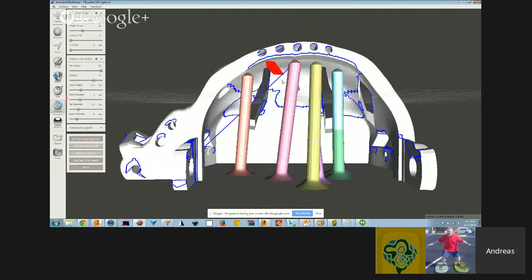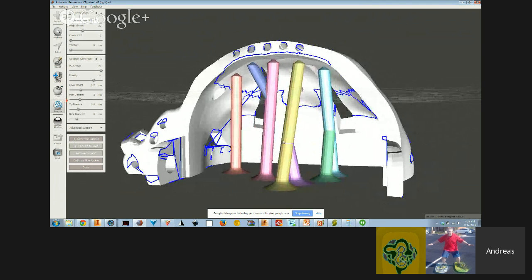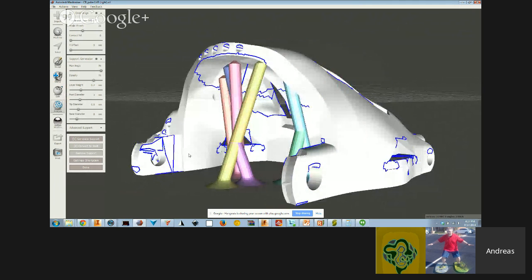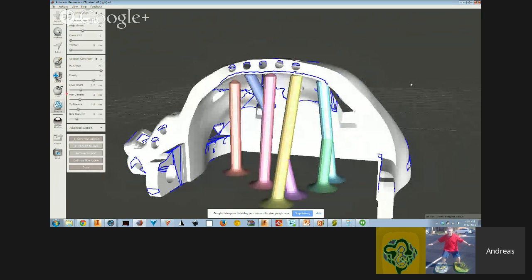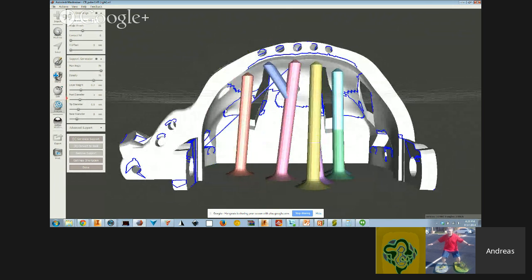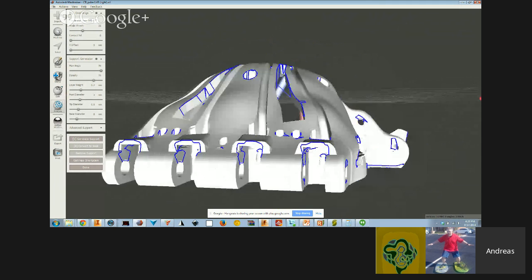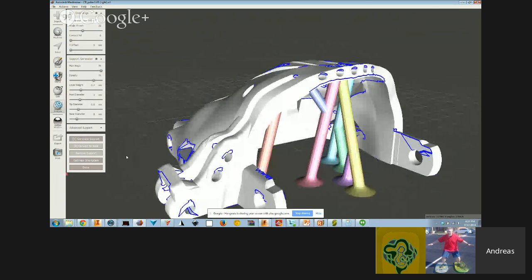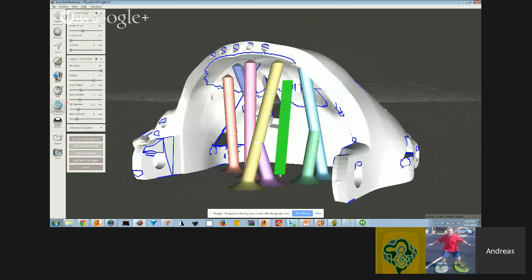You can also do this. Okay, well, I want to branch this guy up from there, right? So that's kind of an interesting take on this. This is going to save more time, and looking at it, you're like, this is a good print, because really the only overhang that I would be worried about is up here, where the angle starts to get really parallel to the print bed. They'll probably survive these little holes right here, and some of this stuff here would print, right? Yeah. So in this case, I'd probably be more comfortable. I could add a few more, maybe back here, but I'm pretty sure that it would get through those.